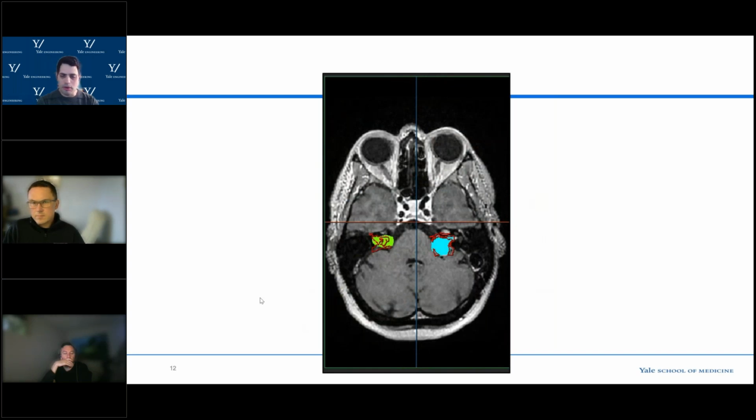And if you are a patient and you want to know if your tumor is growing, a radiologist might look at a few slices of an MRI and give you an approximate XY dimension growth over time. But it's approximate. It's not always very accurate. It's very user dependent. And so the thinking was, let's see if we can automate the process of creating these models, where maybe it won't take 4 to 5 hours. Maybe it'll take just a few minutes.